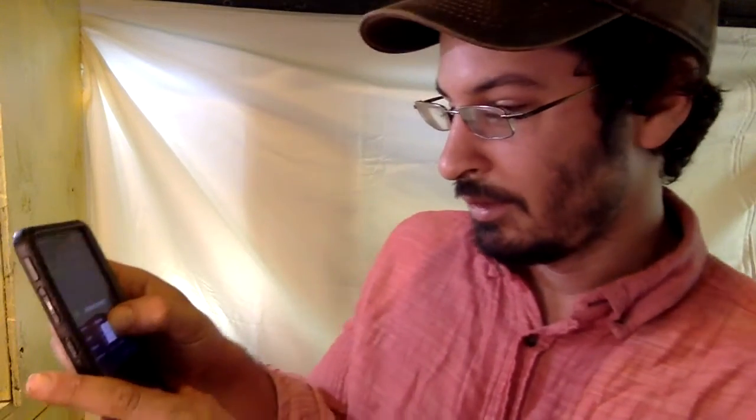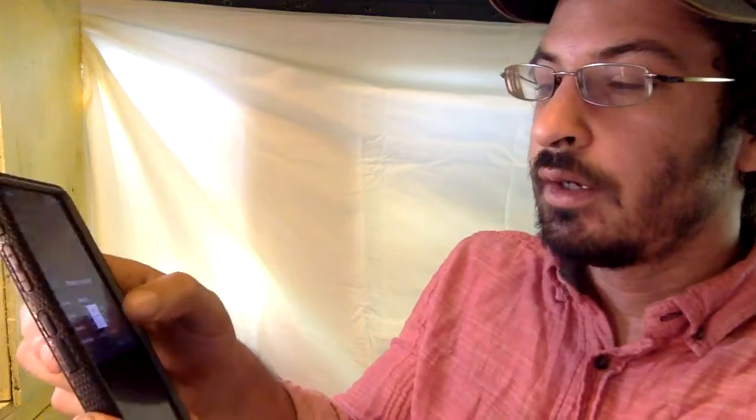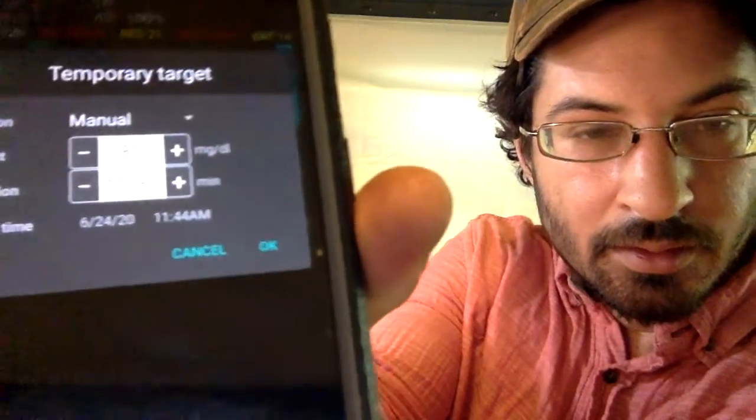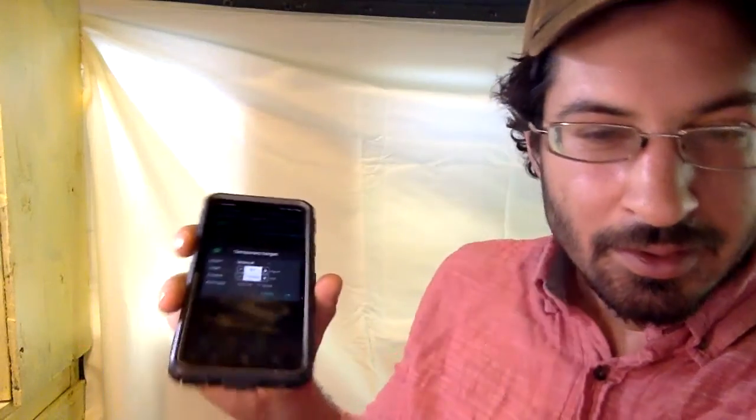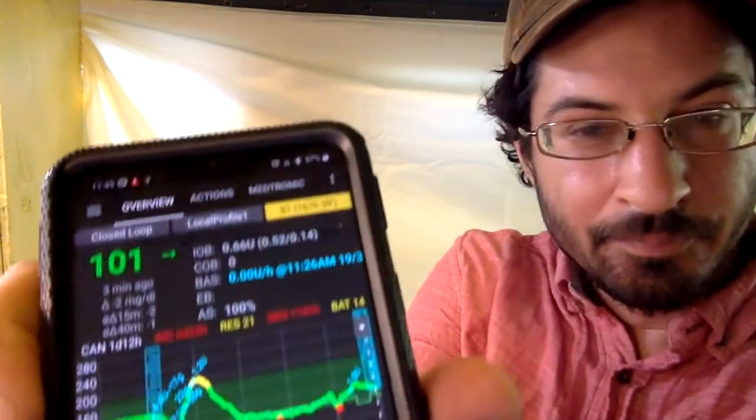However, I can set a custom temporary target. Click that off. For, let's say, 81. You see that? I can set it for 81. And then duration, let's see how long it lets me put it in for. I think the maximum is around a week. So 10,000 minutes. Yeah, so I'm going to angle the phone. There we go. Okay, so I can set a temporary target, and then it'll pop up 81 for the next 168 hours. So there is a way to do that if you're a Bernstein type, and you want your goal to be 83 before, during, and after meals.